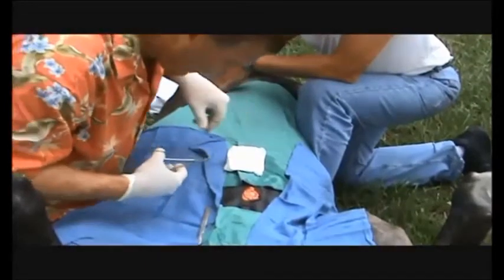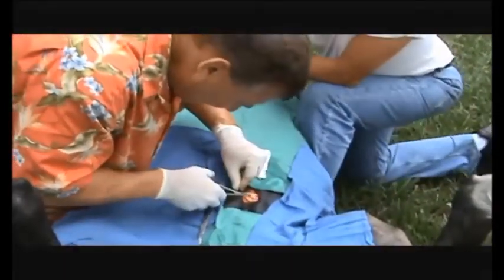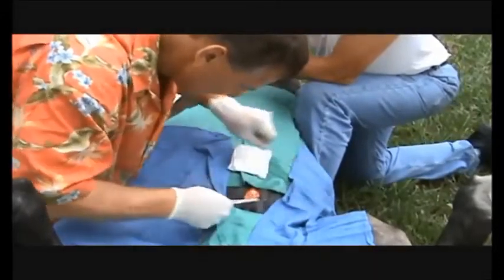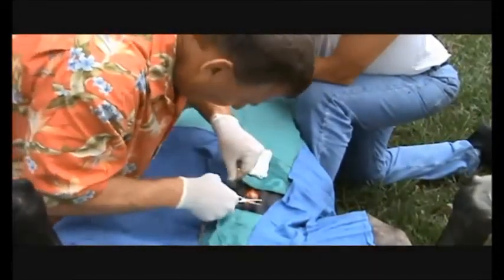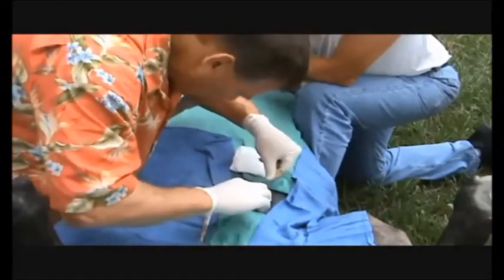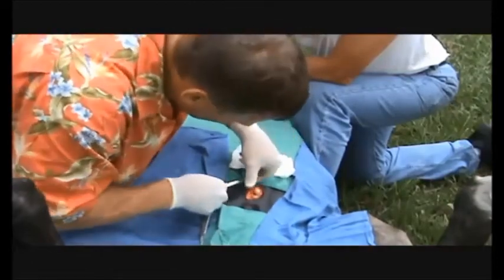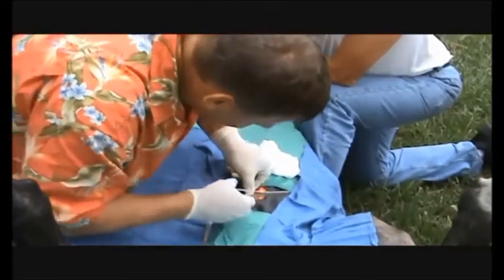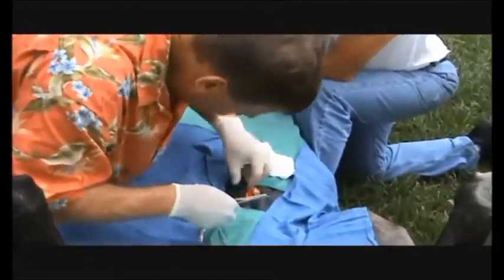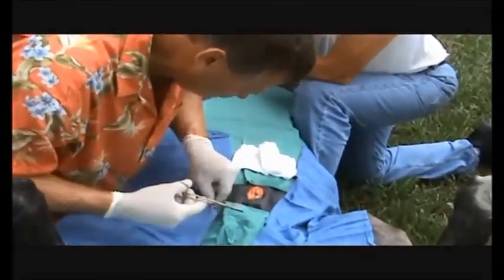Another thing to watch here next on his knot is how he actually performs a granny knot. And this is because if he does a granny knot on purpose, he can tighten it down on the third throw and get rid of some of the tension effects. So there he just turned it into a granny knot, and he can tighten it down further that way on his second throw, because it's sliding still. After this he's going to do good square knots, but he deliberately did a granny knot there just to be able to tighten it down because of some tension. There are other ways to manage that too.